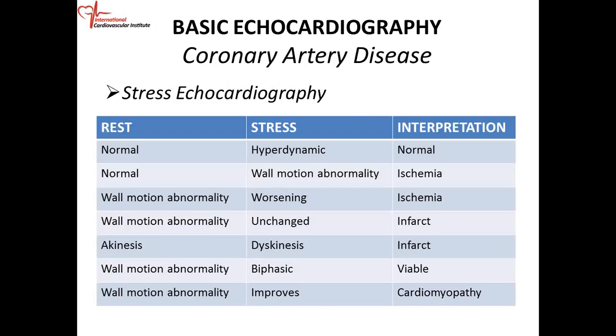And of course, the changes that you're going to look for in the ECG, you're going to see if there's any arrhythmia because it's important. The patient may now move from a sinus rhythm to atrial fibrillation, ventricular tachycardia, AV blocks, so you need to look for these things. But what you're looking for specifically to tell you if the stress test is positive is ST segment deviation. And the deviation that you're most concerned about is ST segment depression.